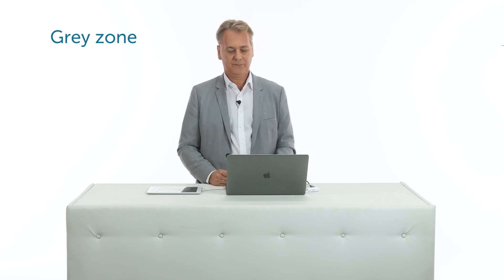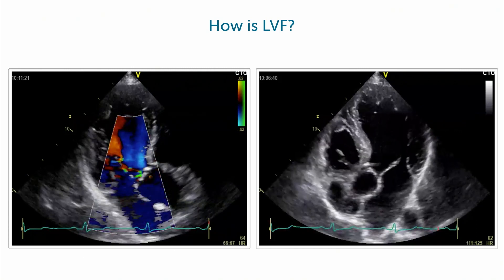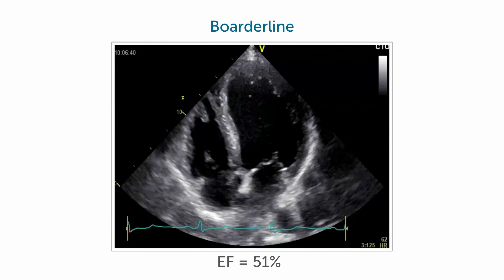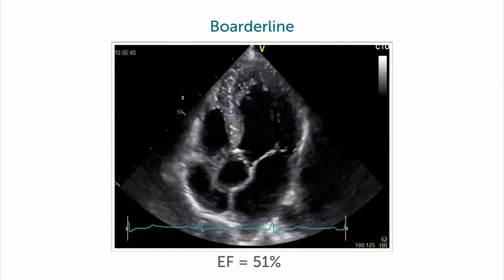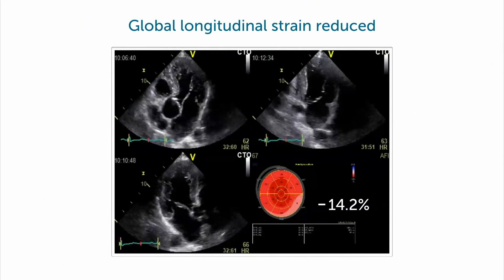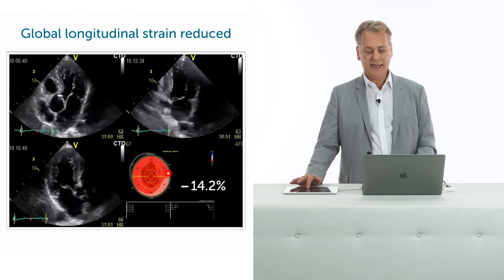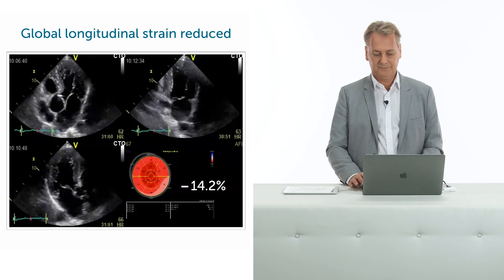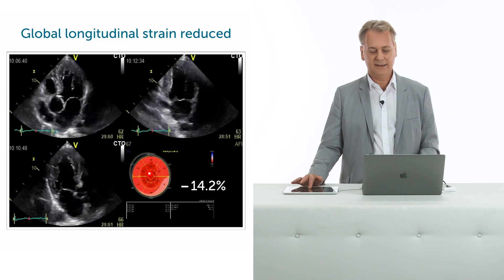Next case — how is ejection fraction in this patient? Again significant aortic regurgitation. The ventricle is small and it does look borderline. If you look at the ejection fraction we get 51%, but it's still above the cutoff value. This is his strain — it's 14.2. It's a lot less than the previous patient and it is definitely discrepant from the ejection fraction. Again you see that there is a reduction of strain more at the base than at the apex.